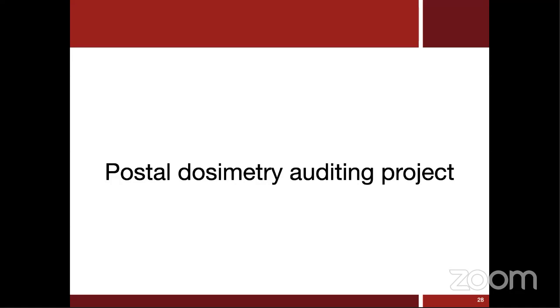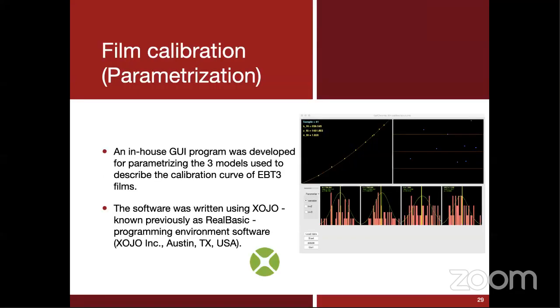The third one was a more exciting one. It's doing postal dosimetry auditing with a student. We were not using just simple Excel, because now when we do the fit, we wanted the parameters with uncertainties to really do some appropriate dosimetry there.